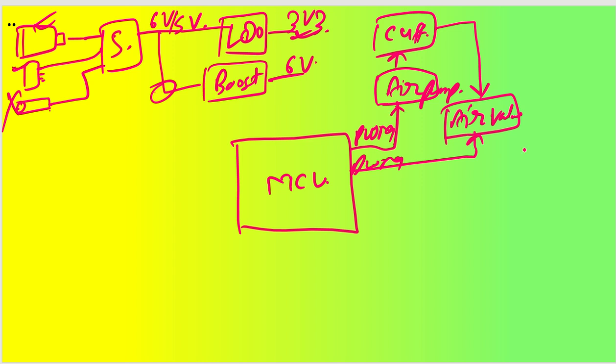Now the best thing that we have to do is, this air cuff will be having an option to connect through the pressure sensor. So this pressure sensor can be analog type or digital type. If you want to have a high end design, then you can use digital type also, so you don't have to work on the ADC's control and everything.